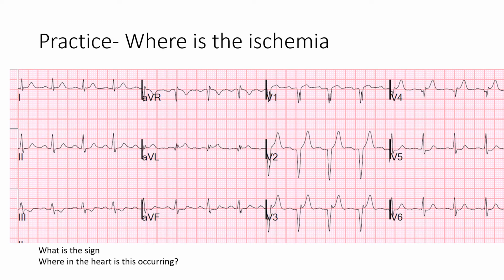So it appears we have ST segment depression in 3 and AVF. We have a Q wave in AVL, and we know that it's normal to see those, but if they're greater than 25% of the R wave, it might be indicative of some form of ischemia. We also can see bundle branch morphology in V1, so there's potentially a right bundle branch block. And we have ST segment depression in V5 and V6. So potential inferior lateral MI, something that we should probably be concerned about.